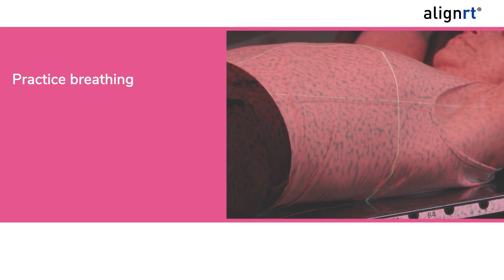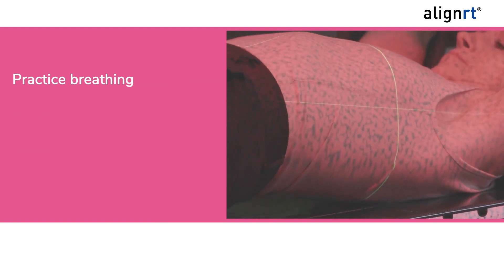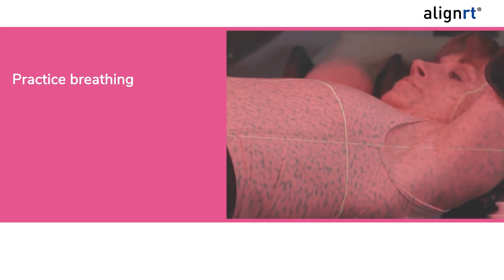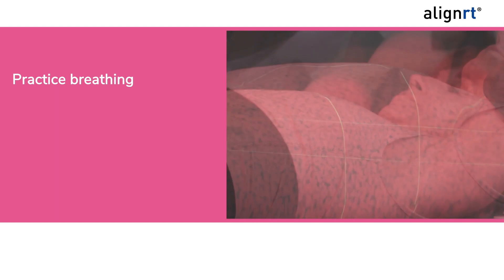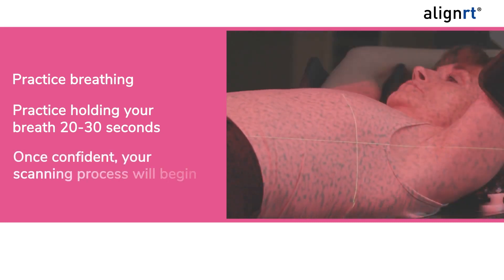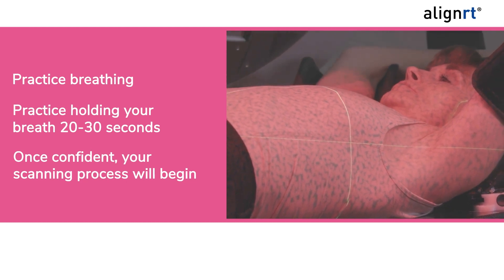Your therapist will repeat this with you a couple of times. As you do this, focus on your breath in. Make sure you are not arching your back as you breathe in, and try to keep your arms and body as relaxed as possible. Once you are comfortable, you will practice holding your breath, working your way up to 20 to 30 seconds.